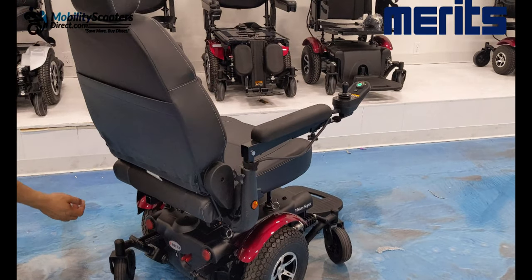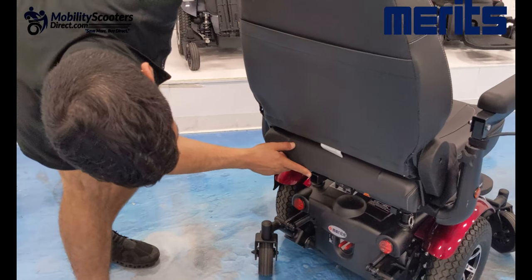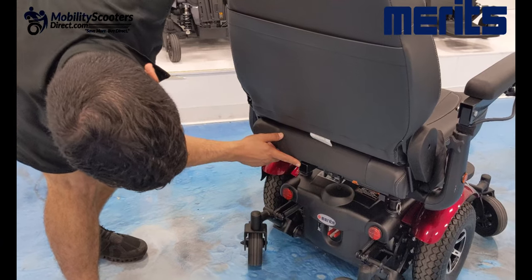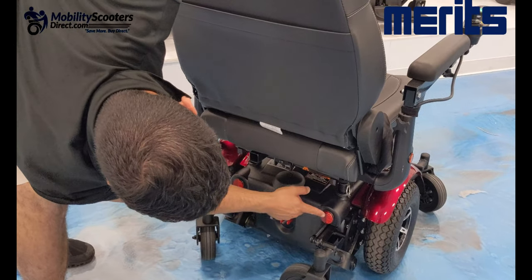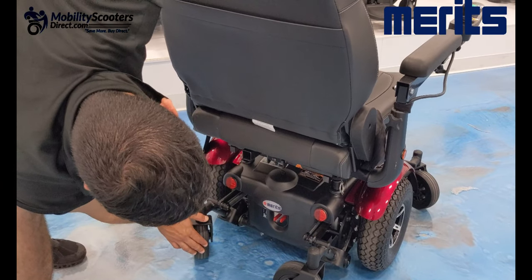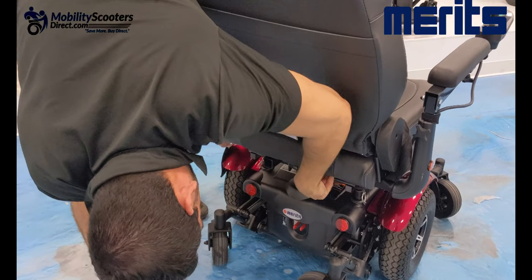In the rear, you'll also notice a universal one-inch accessory port. It can be used for large rear baskets, cane holders, oxygen tank holders, and many other aftermarket accessories. It also has two rear reflectors. This is a mid-wheel drive unit, so you'll have two smaller wheels in the back and two smaller wheels in the front.